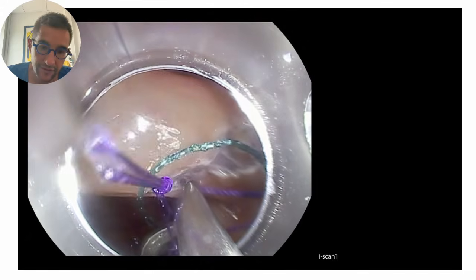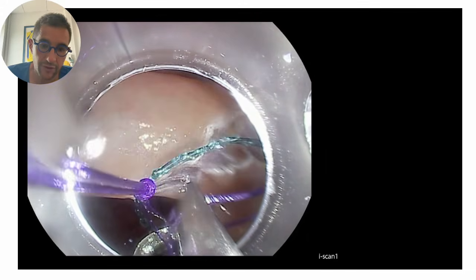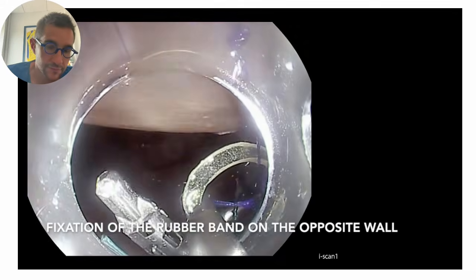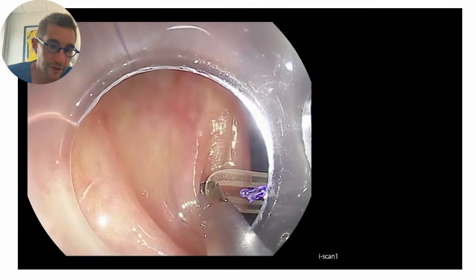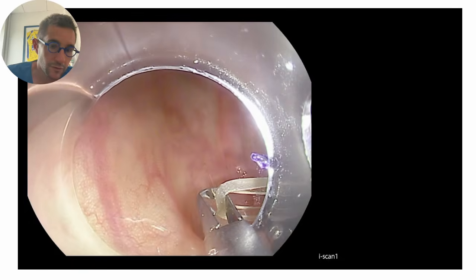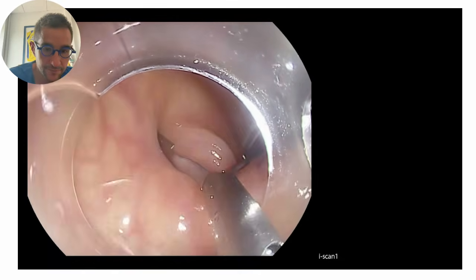And the last of the 4 points on the 4 cardinal points of the lesion, the rubber band on the opposite side to get a strong traction from the beginning. So we deflate and try to go far to have a strong traction.